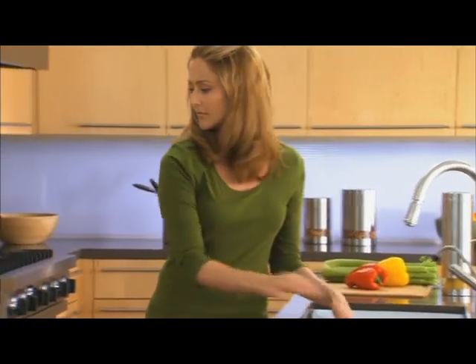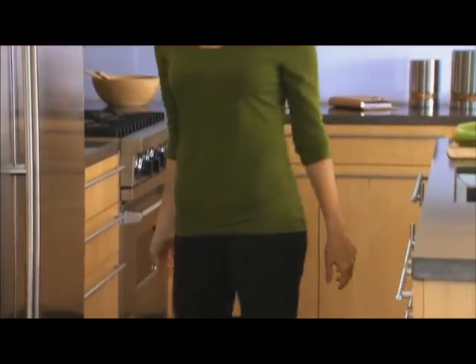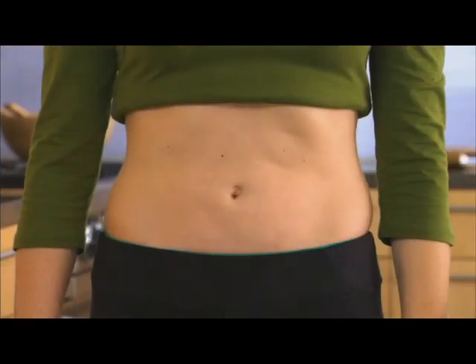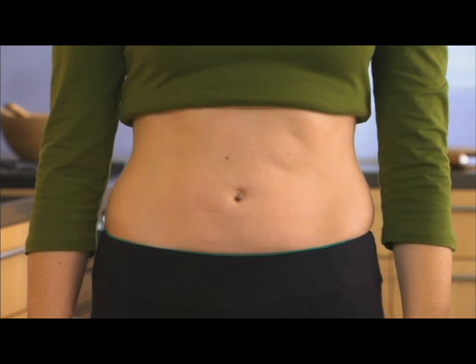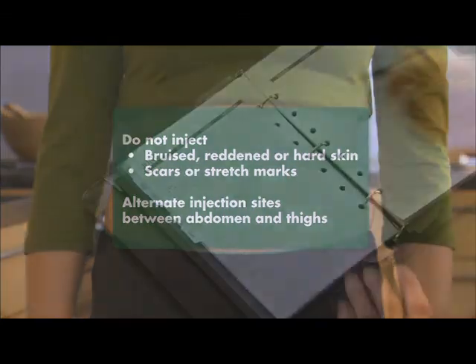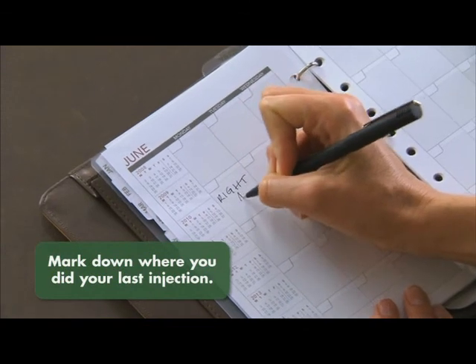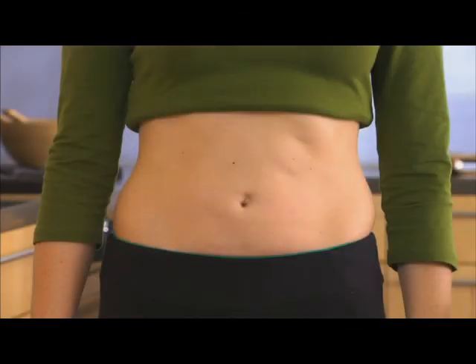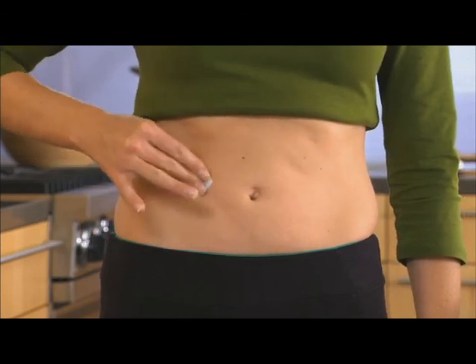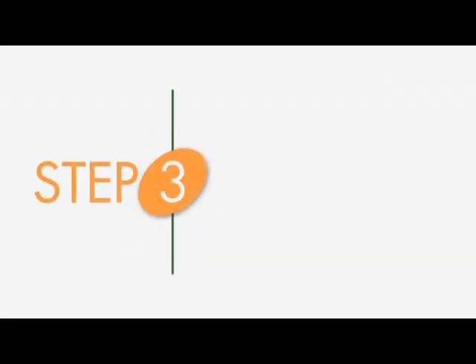Now we are going to inject Symsia. Before you start, wash your hands thoroughly. Do not inject into areas where the skin is reddened, bruised, or hard. Change injection sites between your tummy and thighs to reduce the risk of reaction. You may find it helpful to keep notes on the location of injection sites you use. Wipe the injection site with the supplied alcohol wipe, using a circular motion moving from the inside out. Do not touch the clean area again until you are ready for the injection.